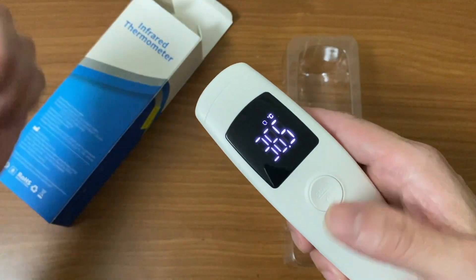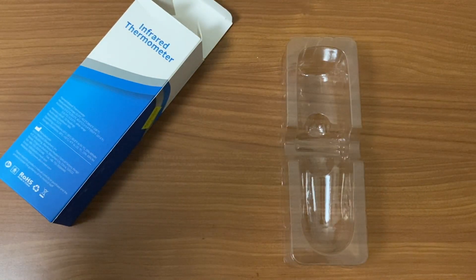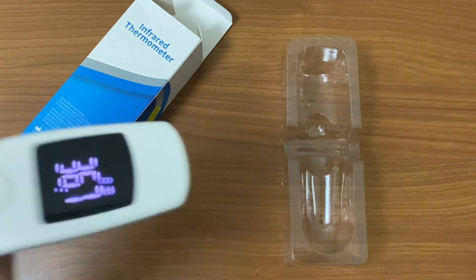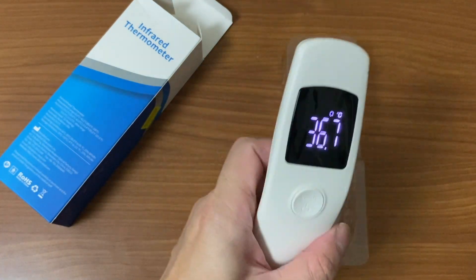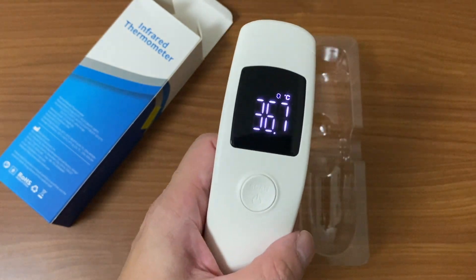Reading on the hand is 36.5, which is normal. Let me do the forehead quickly — press it once and point at your forehead. That gives 36.7 for my temperature. You can see it's currently set to Celsius.